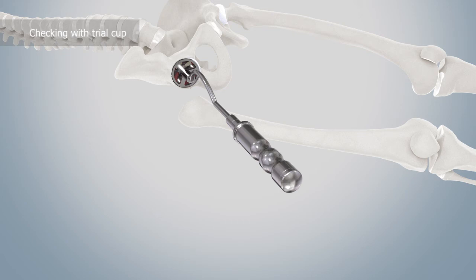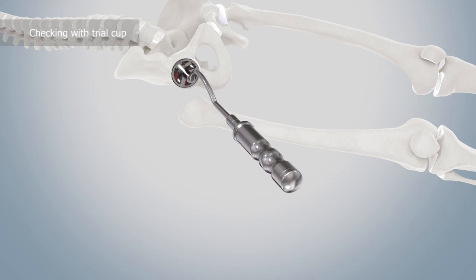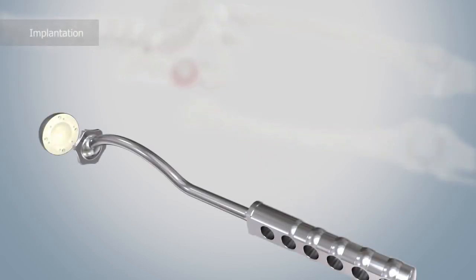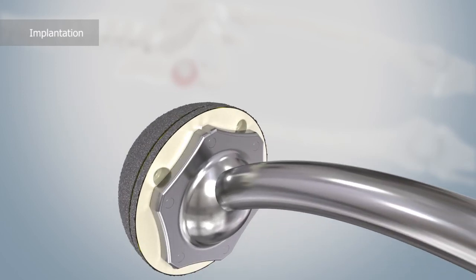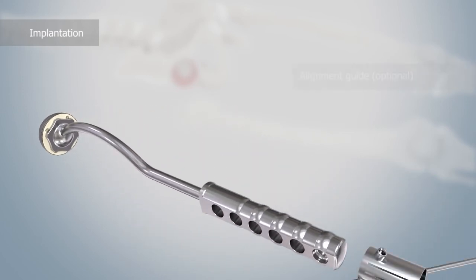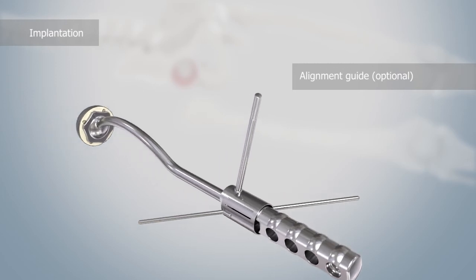The trial cup can be used to check sphericity of the reamed acetabulum, secure seating in depth, lateral protrusion of the cup, and the desired cup positioning. It is important to note that the fit of the final cup implant should approximately correspond to that of the trial cup. To insert the final cup implant, it is firmly attached to the cup positioner. Optionally, an alignment guide can be slid onto the RM Pressfit cup positioner.